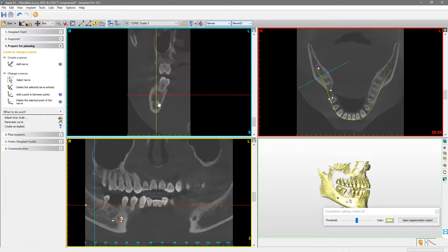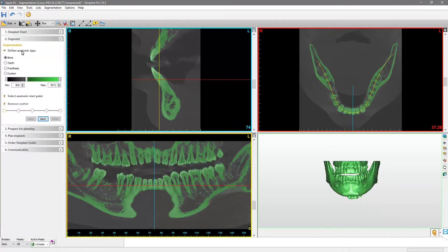Finally, we will create a rough 3D model of the patient's bone via the segmentation wizard. Start with the anatomic type, bone, and if needed, adjust the threshold by moving the slider from left to right.